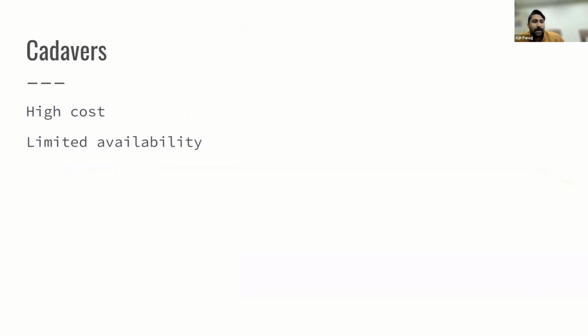And then come cadavers, the last thing we'll talk about. These are pretty high cost and of limited availability, so you really do have to be at a big institution to have access to cadavers. We are very lucky to have access to cadavers here at Loma Linda, but many institutions are not, and so this doesn't have as much generalizability to the community as some of the other models.